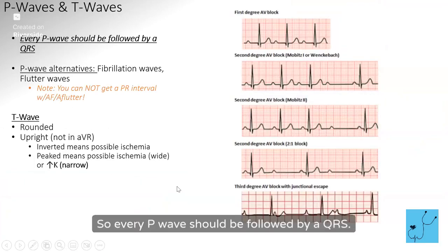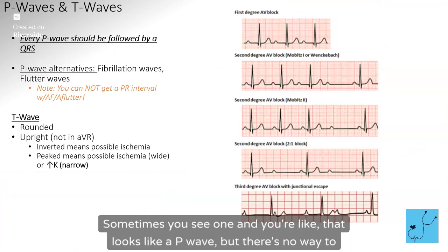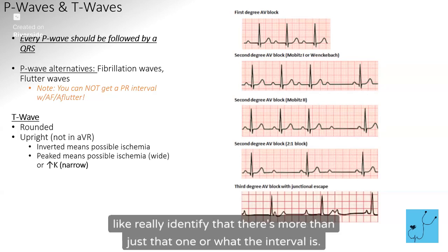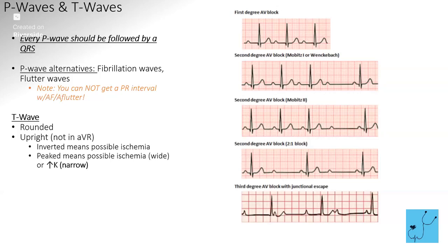So every P wave should be followed by a QRS. You cannot measure a PR interval in AFib because you cannot find a discernible P wave. Sometimes you see one and you think, oh, that looks like a P wave, but there's no way to really identify that there's more than just that one, or what the interval is.